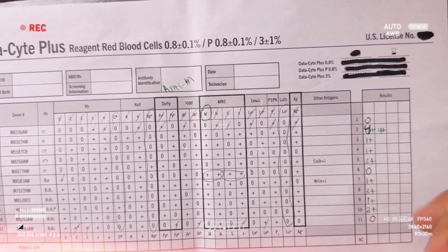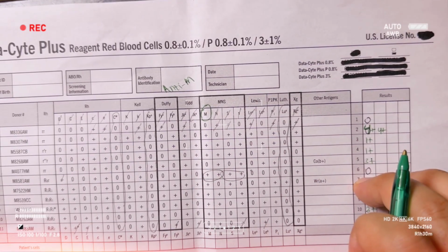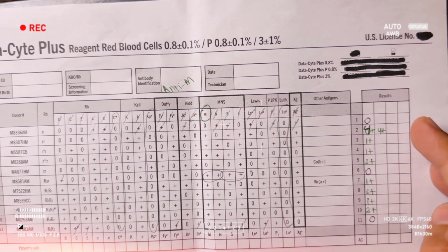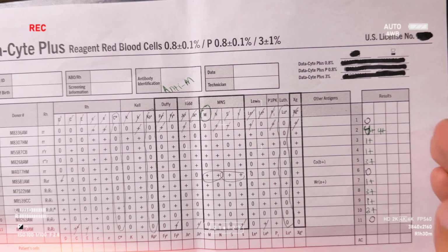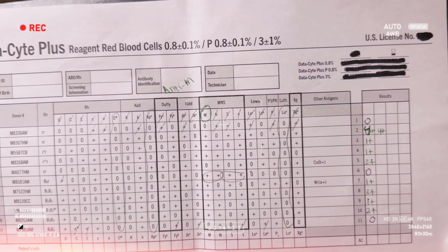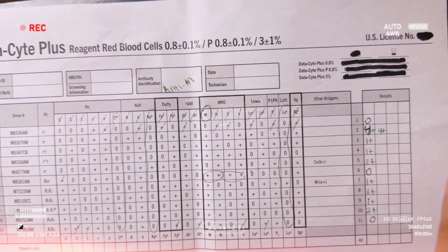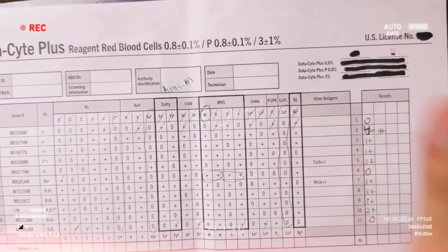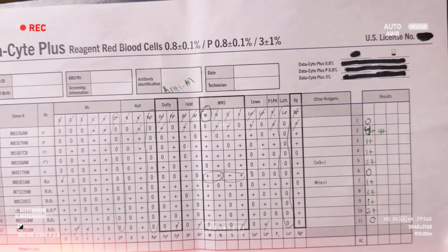There are certain cases where you will not be able to rule out everything here, and you can run another panel too, but if you still were not able to rule out anything, that could be a non-specific or warm autoantibody, in certain patients like those with multiple myeloma, or patients on certain medicine like Darzalex. Their immune system produces certain antibodies that can interrupt the pattern, so you will not be able to rule out anything. You can call that non-specific antibodies. And there is further investigation needed for warm and cold autoantibodies.